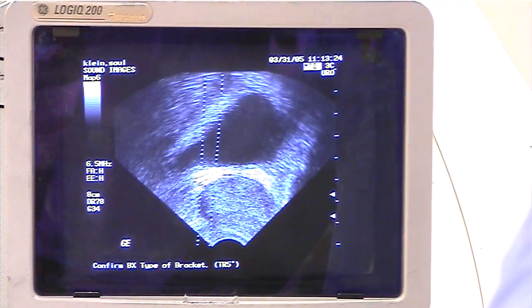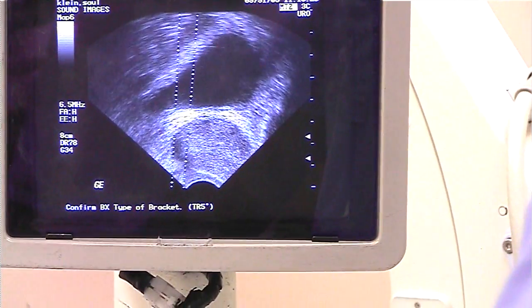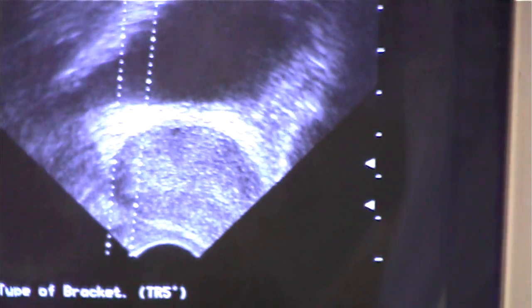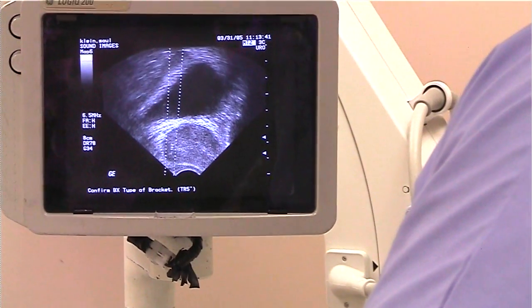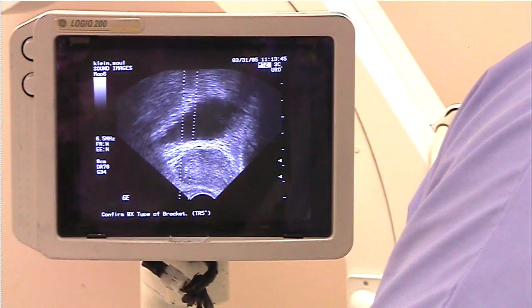Can you see the needle going in there? Through the rectal wall you can see the actual needle going in. Let's draw quickly — and there you can see the seed. Just a little punch in, right there. That looks perfect.